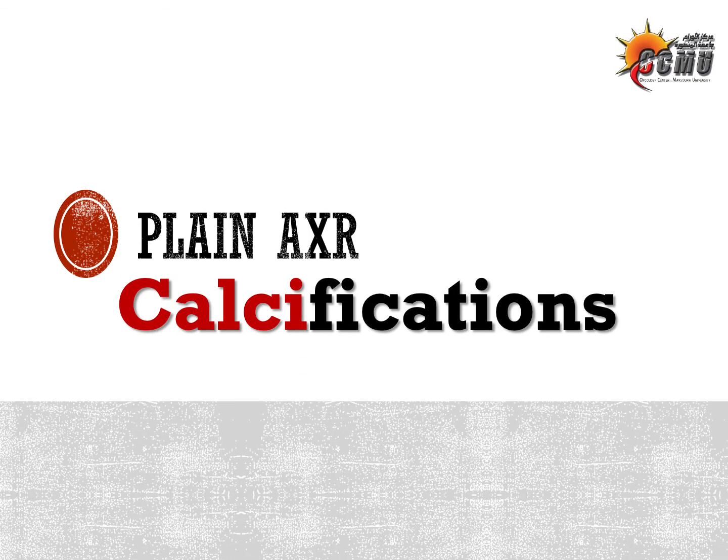So that ends our talk about the abnormal gas patterns. If you want to review the calcifications that may be abnormally found in a plain abdominal X-ray, then it's okay. I'm going to skip that because actually it's not related to cancer processes. So let's skip that and let's get to the next point in our lecture.